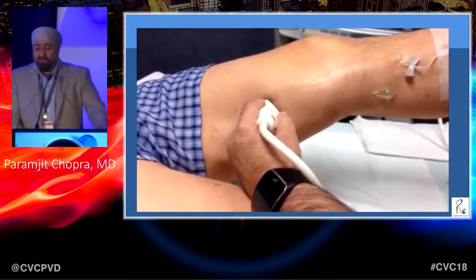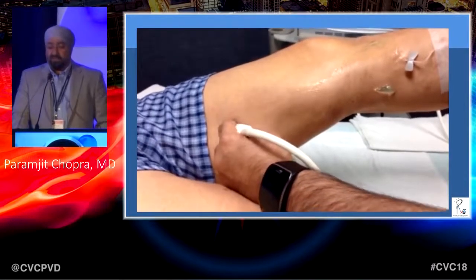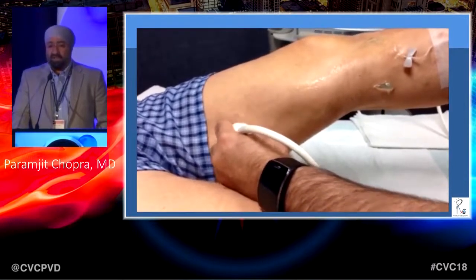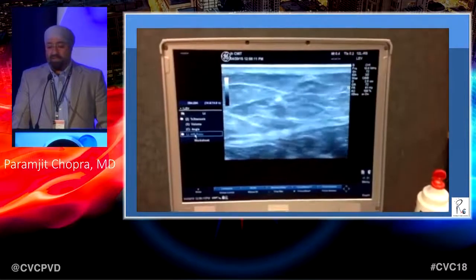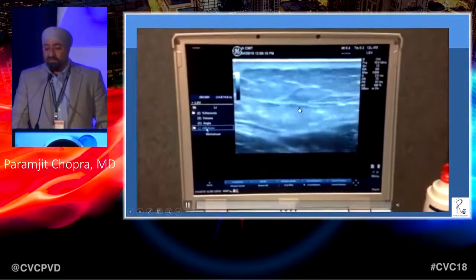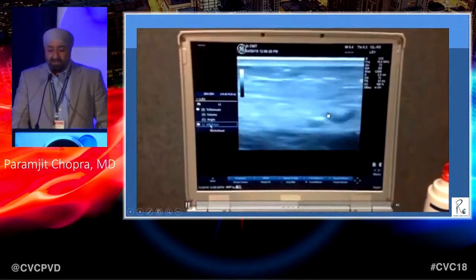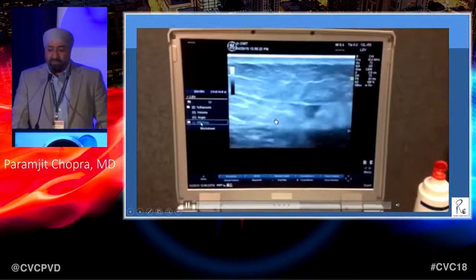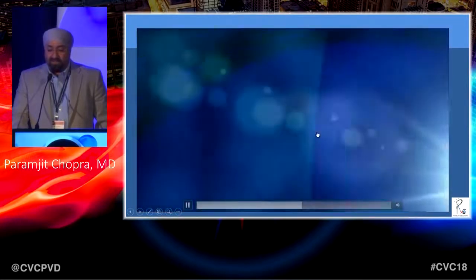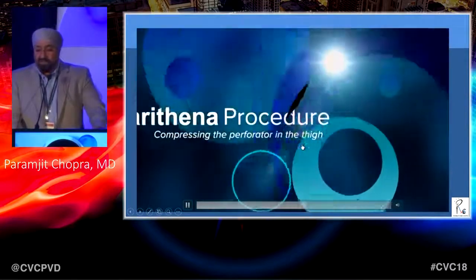Allowed that to wash away. The other part of this that at least the company talks about is that it contains a lot of oxygen and carbon dioxide and very little nitrogen, so it dissolves in the blood. But as Ron showed, I make sure it goes into those branches. And you can see how with all this, because he's had previous treatments, there are all these kind of curlicue branches, nothing that you could do with thermal directly.